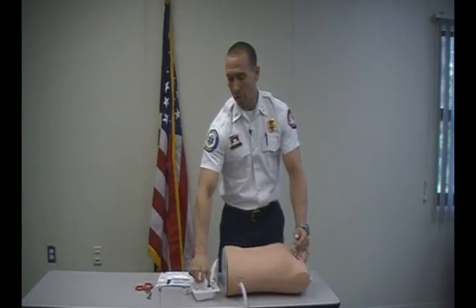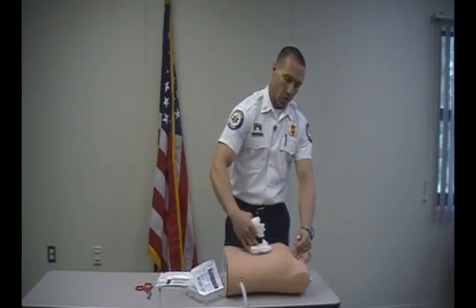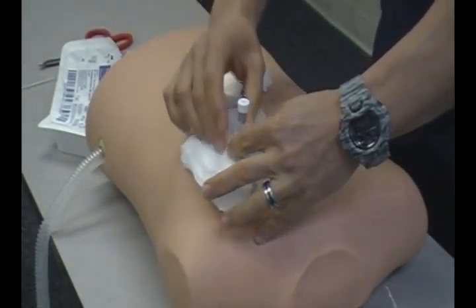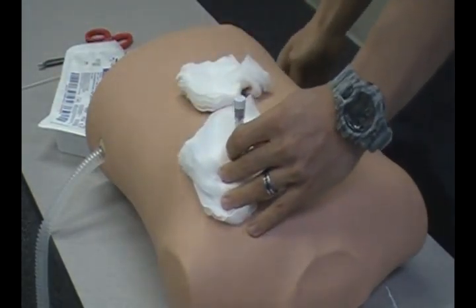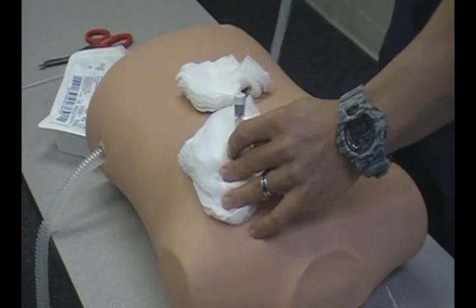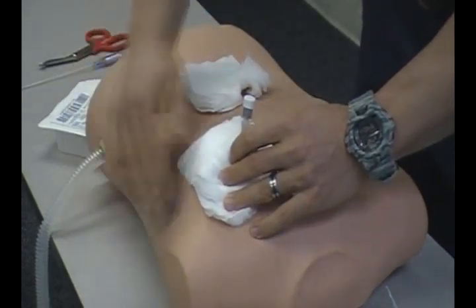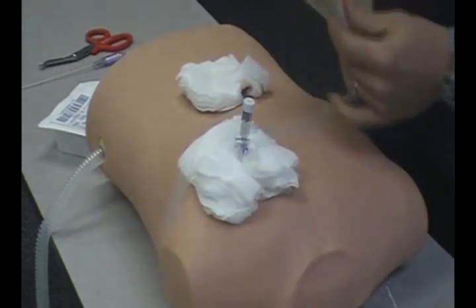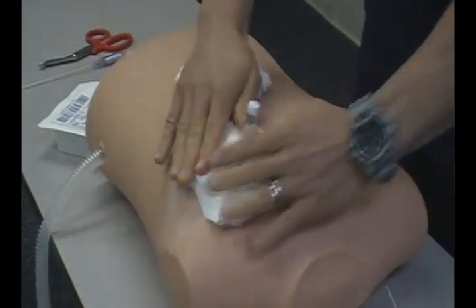Take your 4x4's and use just the amount that you need. Then take your strips of tape and make sure that we secure it.